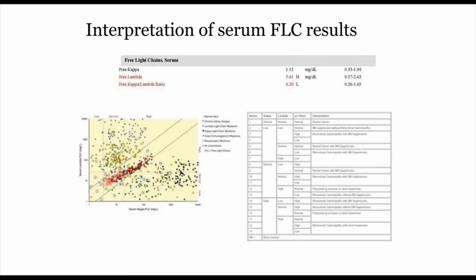When you run the assay on other third-party manufacturers, for example, when you run the free light on the Optilite, there are mechanisms in place to detect the antigen excess. When you run assays on other platforms such as the Architect or other third-party instruments, there is no specific mechanism to detect it.